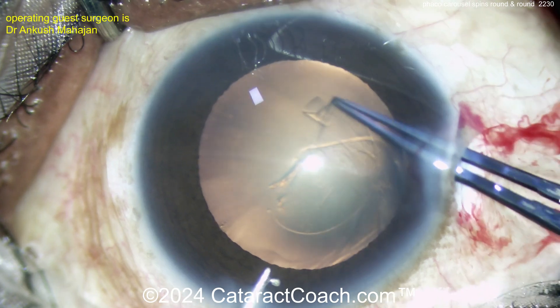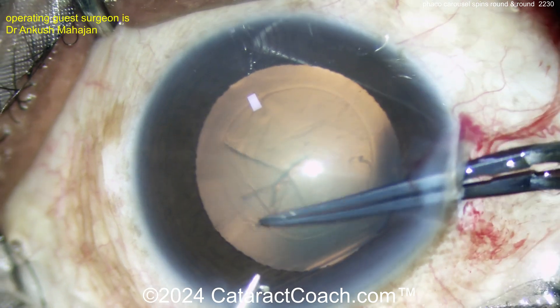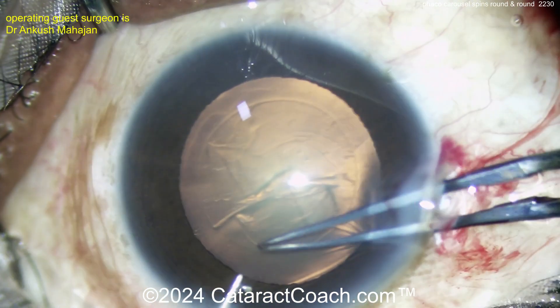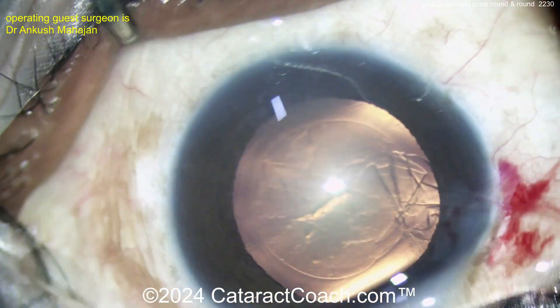Now let's get the rhexis done. For this carousel technique, you want to get a nice, generous rhexis — it looks like about a 5mm rhexis. Beautifully done here, obviously a very experienced surgeon. Clean looking rhexis, I like it.